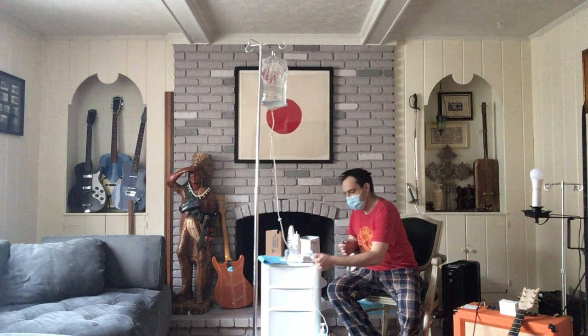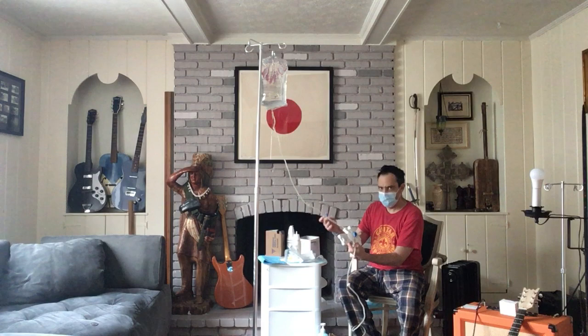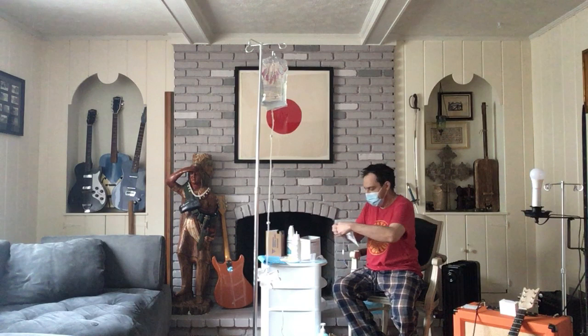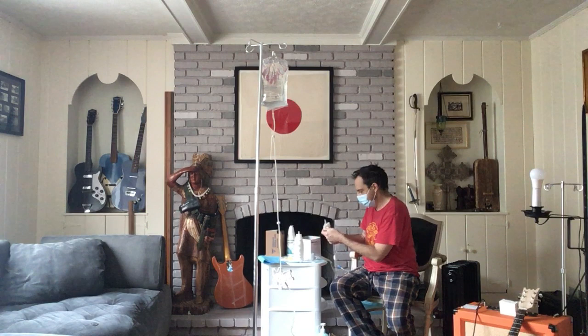And we already wiped down our fancy thingamajig. So, there's a spot that says extension. We dropped it. So we're going to have to wipe it down again. Yay! All right. Tear this open. Spray that down ever so hastily. Put it back into some gauze. Just let it sit there for a second.